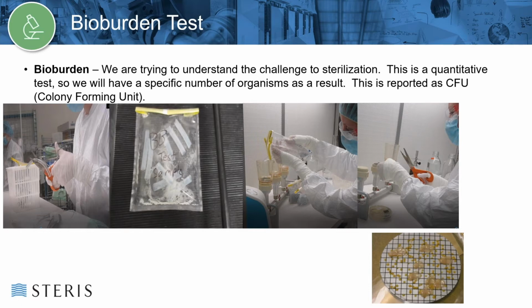Whichever culturing technique is selected, the method is validated to measure the efficiency of the method and correct the result with the use of a correction factor. There are two methods identified in ISO 11737-1 for the determination of the correction factor. Both methods have advantages and disadvantages.